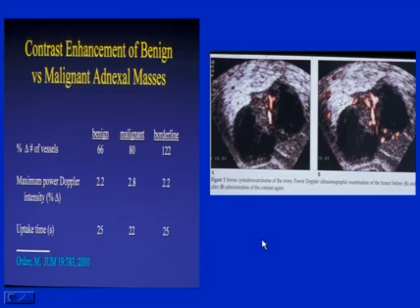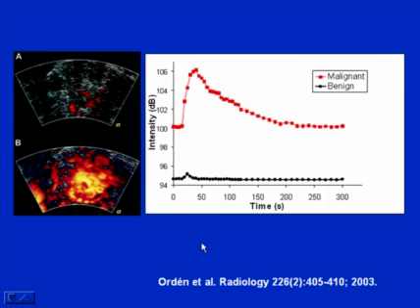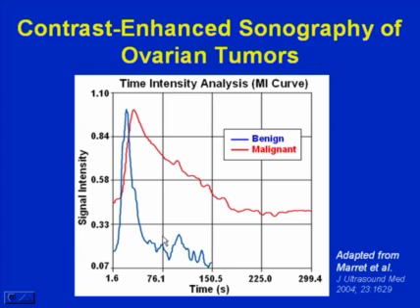The first study was from Finland, where they used Doppler, and Doppler has the problem of decreased temporal resolution and blooming, but they did find a difference in uptake time in tumors versus non-tumors, and this is a follow-up of their study showing that tumors had overall increased intensity and longer dwell time. This is a study from France which confirmed that.